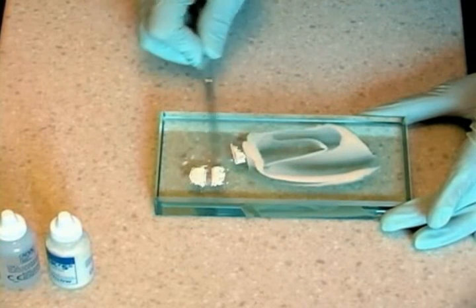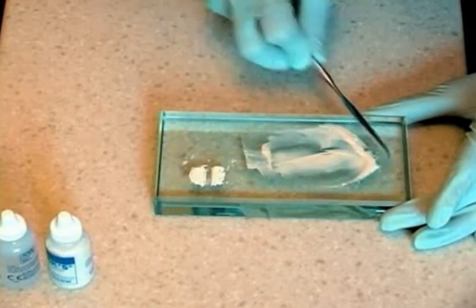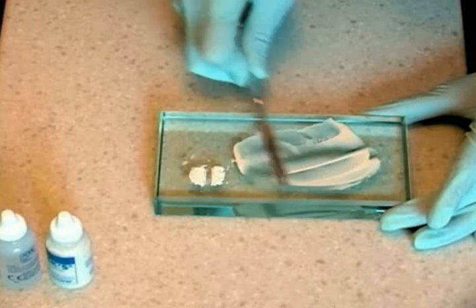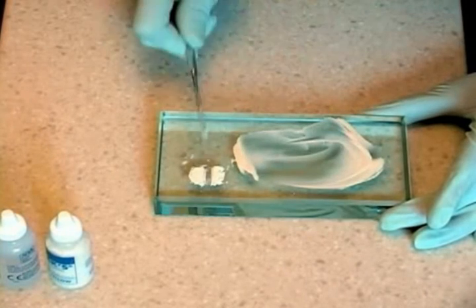Next, mix in the larger quarter sections using the same motion, spatulating for twenty seconds. Repeat for the remaining two quarter sections.